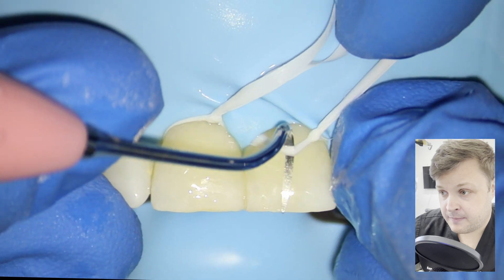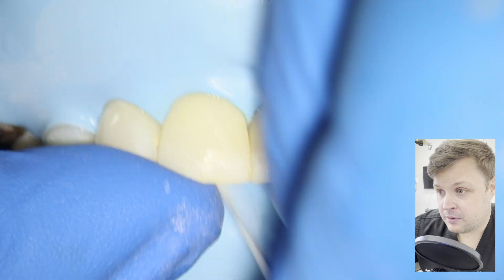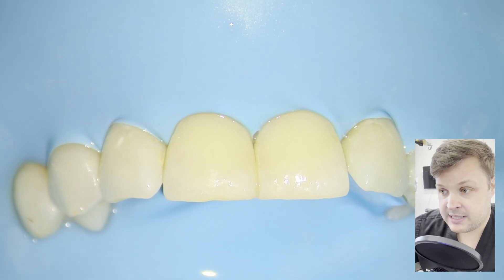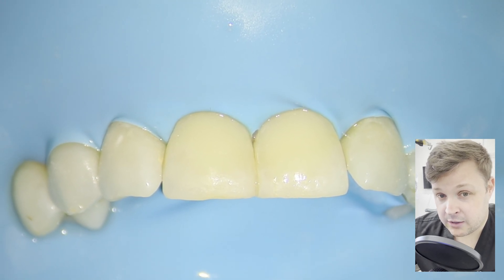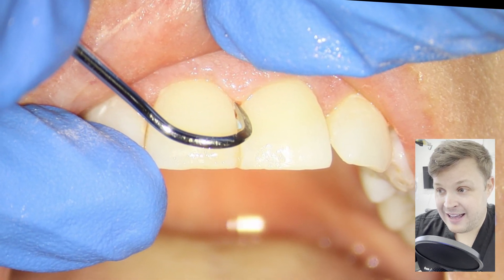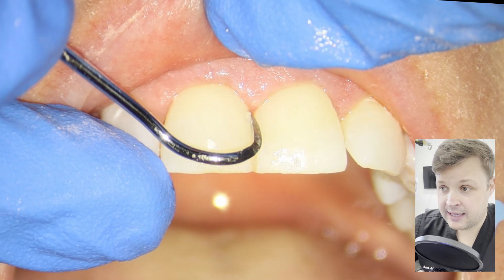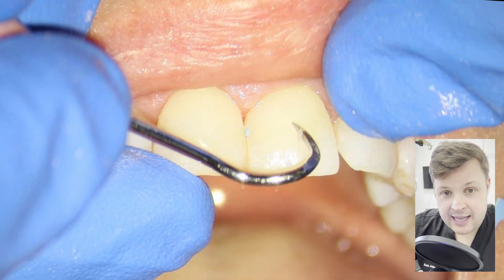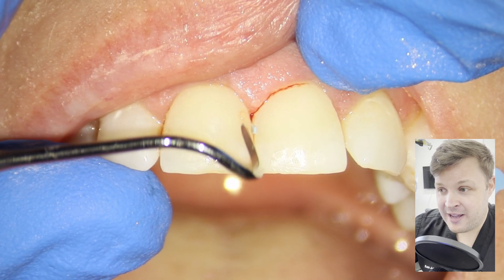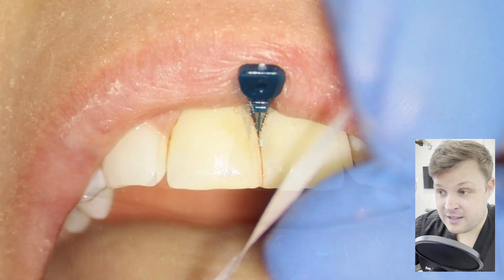I'm removing the floss ties now — I remember struggling with this and having to get scissors to cut it off, but luckily it came off okay. I'm pretty happy with the polish. I'm going to take the rubber dam off and have a final look at the mesial aspect of the tooth. When I pulled the dam off I left a little bit of dam behind and there's also a very small amount of flash where the bond collected underneath the dam. I really like sickle scalers for this — they're great for removing flash, which is also useful when doing posterior composites. I'm using a small wedge to remove the remaining rubber dam.